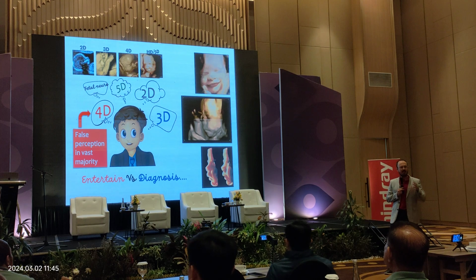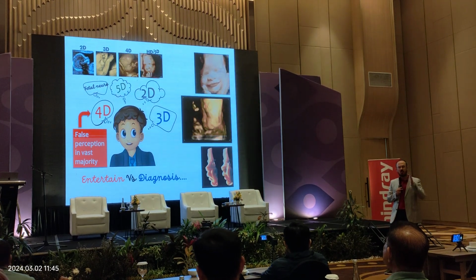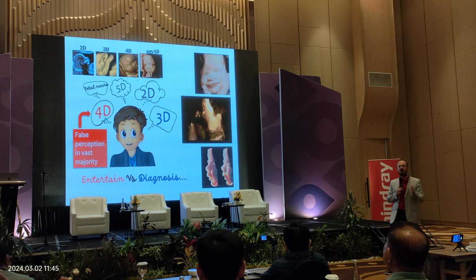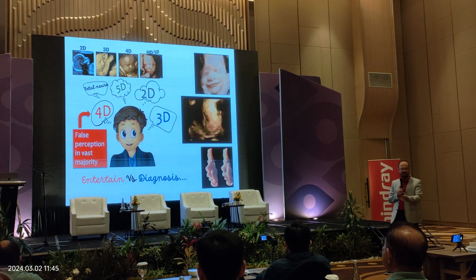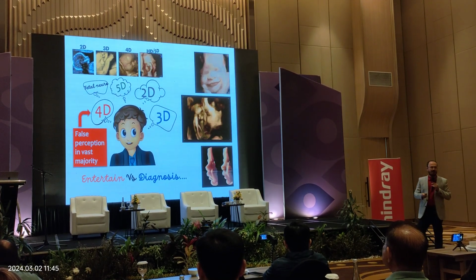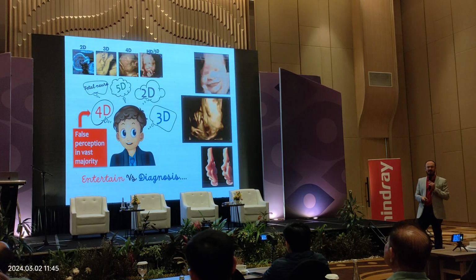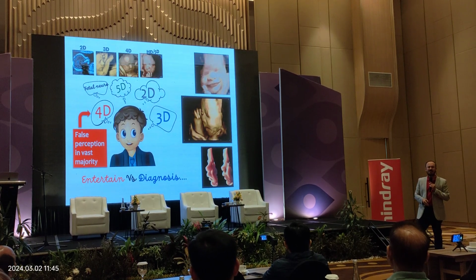We need to find out the contractility of the myocardium and the valve movement so we can measure the cardiac morphology and function. So here, I will try to describe three-dimensional neurosonography, and please tell the patients this is three-dimensional, and don't make them disappointed.